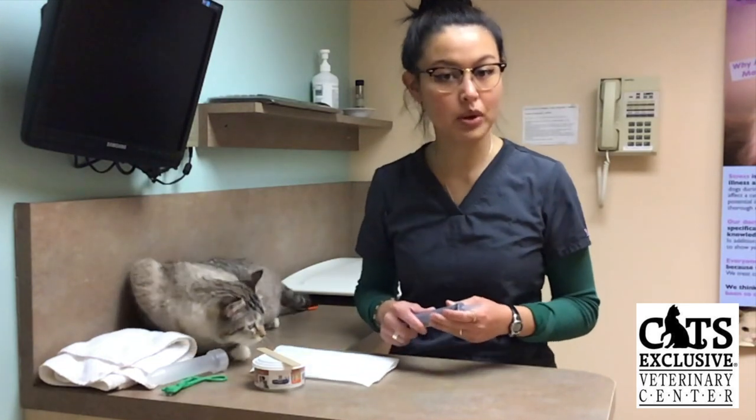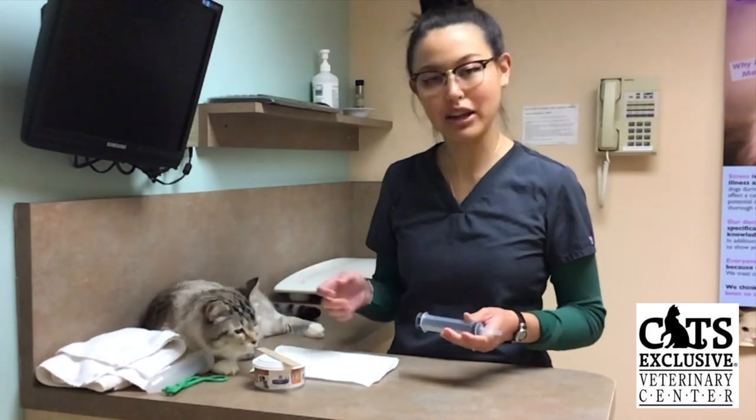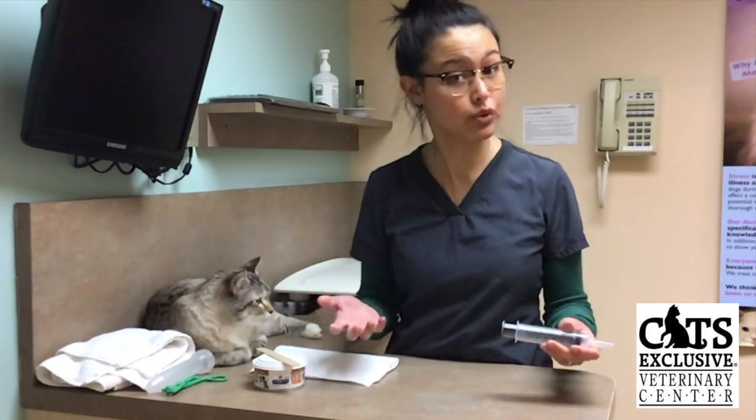Hi there, my name is Jasmine. I'm one of the Veterinary Assistants here at Cat's Exclusive, and today my kitty Momo and I are going to be demonstrating how to hand feed your kitty, or syringe feed your kitty.